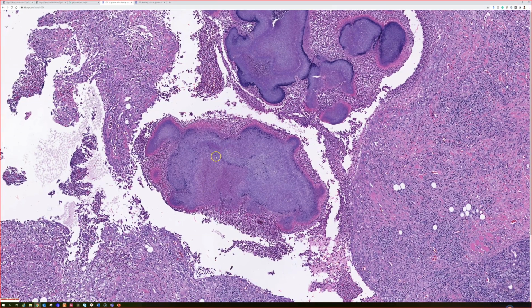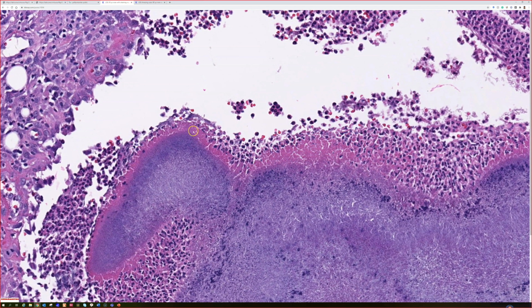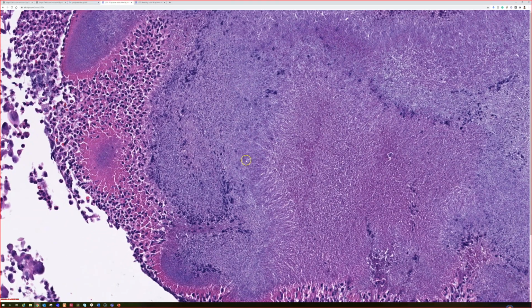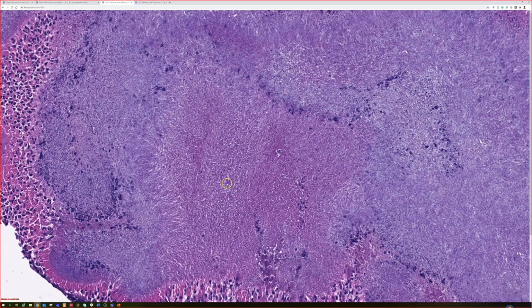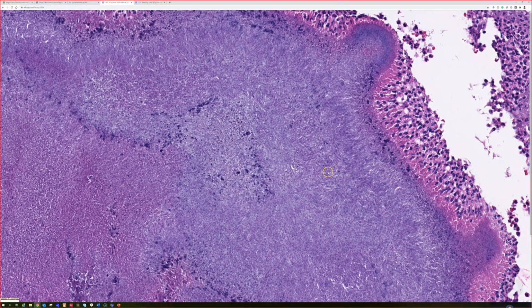This was actually an infection in the mucosal lip, and you can really see that bright pink Splendore-Hoeppli phenomenon, which is basically antigen-antibody complexes depositing all around the edge of this nodule. And in this one, you can see right here the thin bluish thread-like filamentous structures, way too small to be fungus. You can use GMS and Gram stain to help you sort out whether you're dealing with bacteria or fungus, but usually the fungus is bigger.